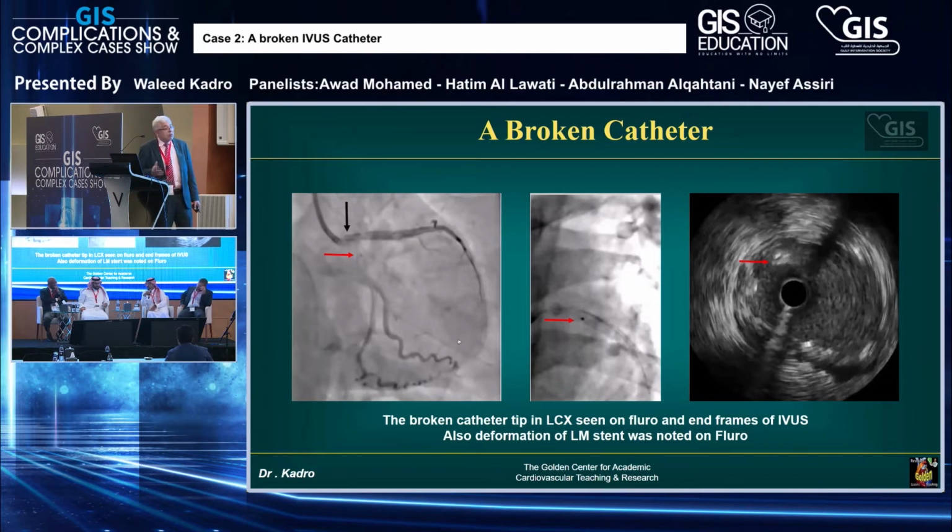Well, I'll tell you what happened. You still have a wire beside? Where? In the circumflex? The wire is still not pulled. In the circumflex you have a wire, or no, just the LAD? No, unfortunately, when we were pulling that, the wire came out from the circumflex.